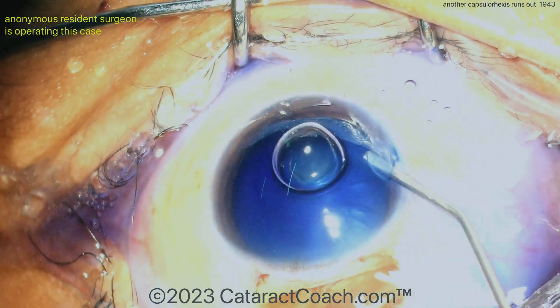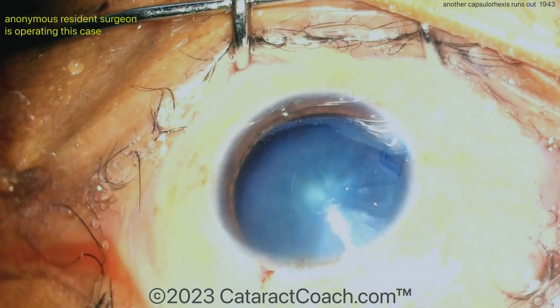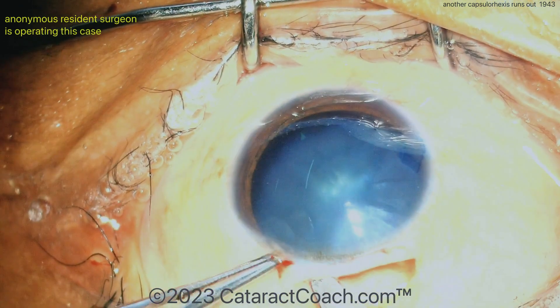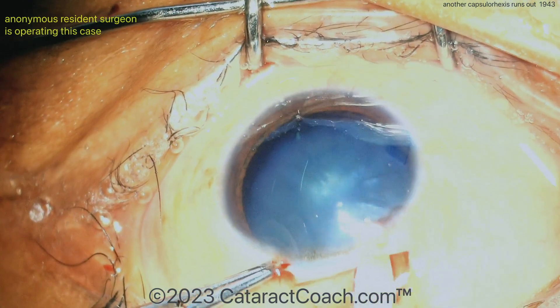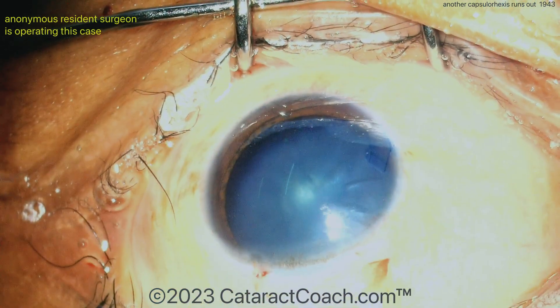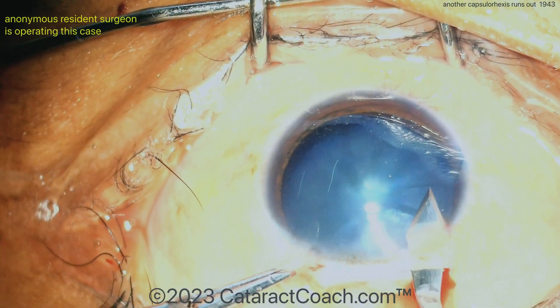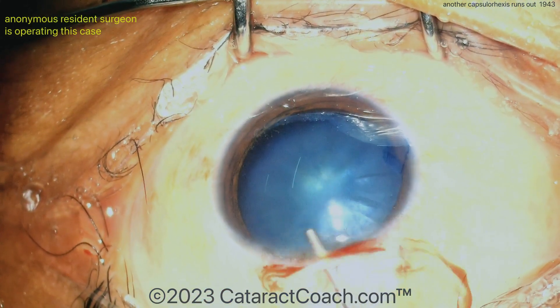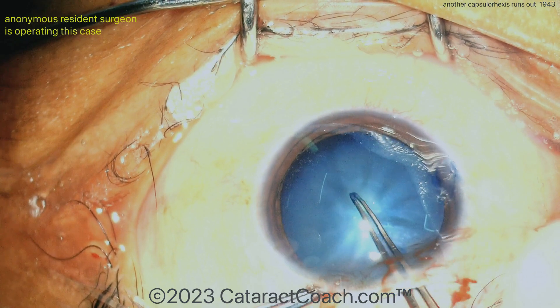The blue dye is going to stay in the capsule. The eye is not quite in primary — look at the Purkinje light reflexes. You either tilt the chin up or fixate the eye a little bit differently. Here's using a crescent blade to create the incision. In MSICS, the trick is that incision where the internal opening is a little bit wider than the external — trapezoid shaped — and also to have a nice, appropriately long tunnel length. That looks great. Now entering the eye with the keratome, make sure at the end of that incision and widen it up. Then make the rhexis, then go back and enlarge it.